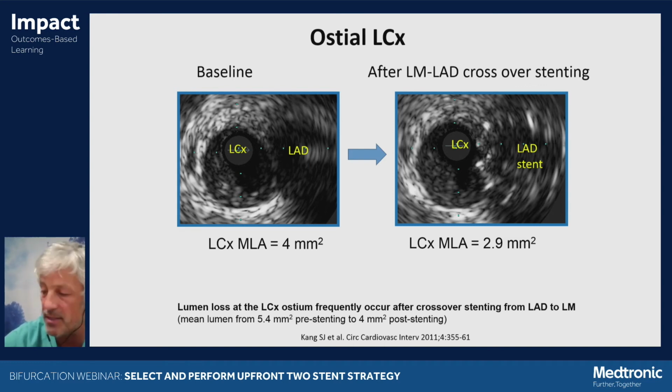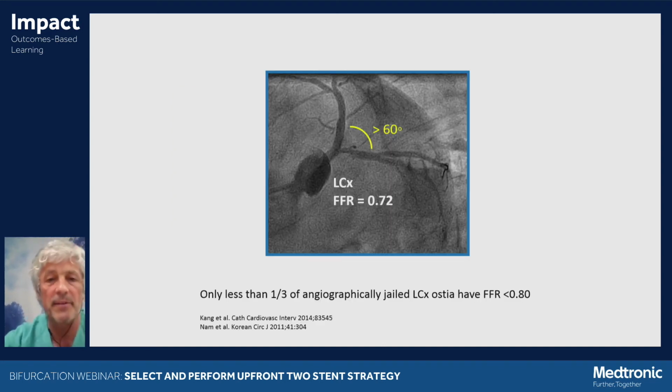And then we have this situation with a small lumen. And because we had the pressure wire on the table, we did FFR in the jailed circumflex, and it is positive now. Of course, the baseline value is not predictive of the result. 0.82 was very close to the border. Then it's reasonable, it's understandable that now we have a positive result.